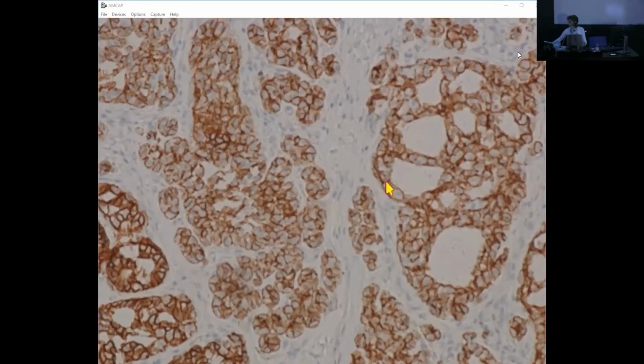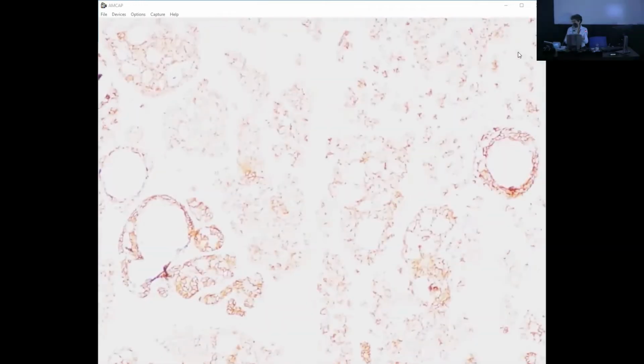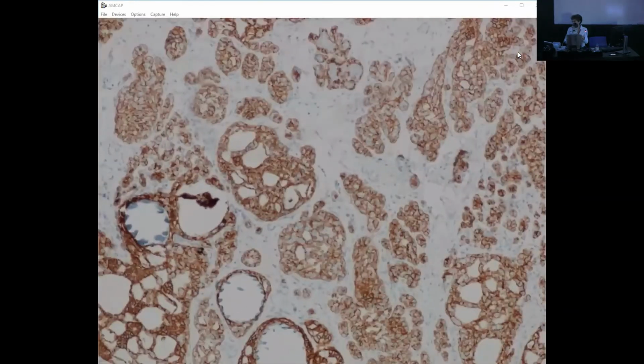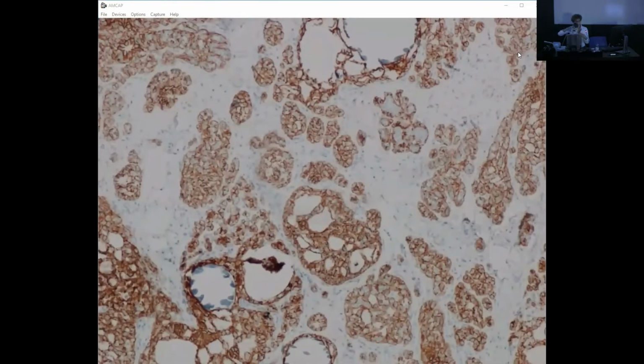Except that focally you recognize they are fried egg cells that touch one another, and they're negative for E-cadherin. Here is that central pattern of staining secondary to the myoepithelial hyperplasia. So it is not infrequent that these lesions at a quick glance, at low power, you say oh, low-grade DCIS, let's do ER. ER is positive. Next case.